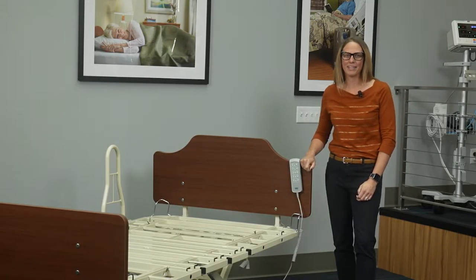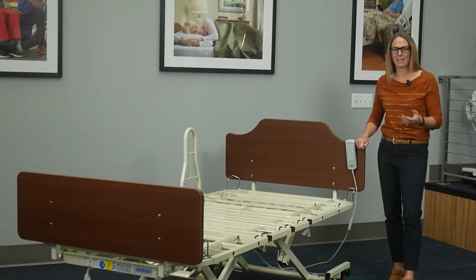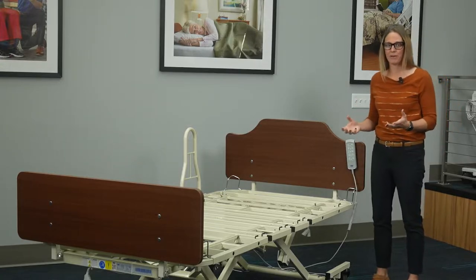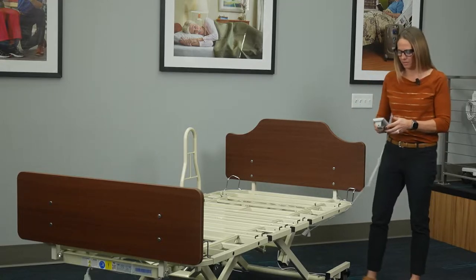Hi, I'm Carrie from Direct Supply, and I'm back with some more ways to help those who help others. Today we're going to talk about the Panacea 8000 bariatric bed. This bed is an extremely affordable full-function bariatric bed that also goes low — and that's something that's pretty different when it comes to bariatric beds.